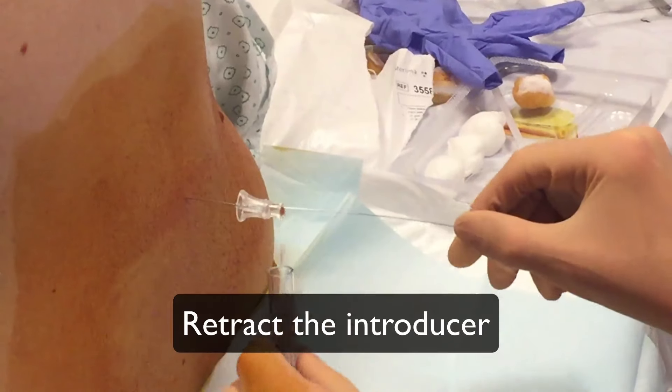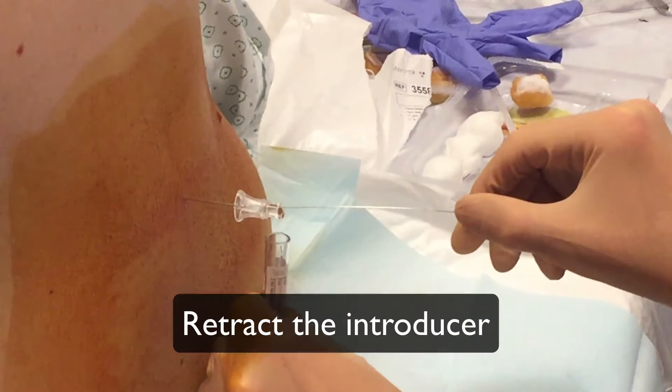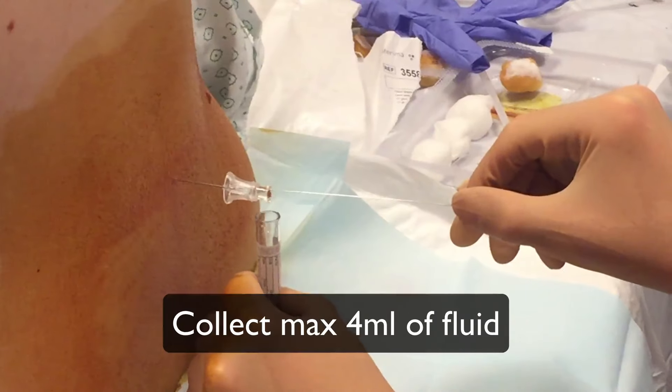Collect the fluid in the recipient. Do not collect more than 4 ml of fluid to prevent headaches.